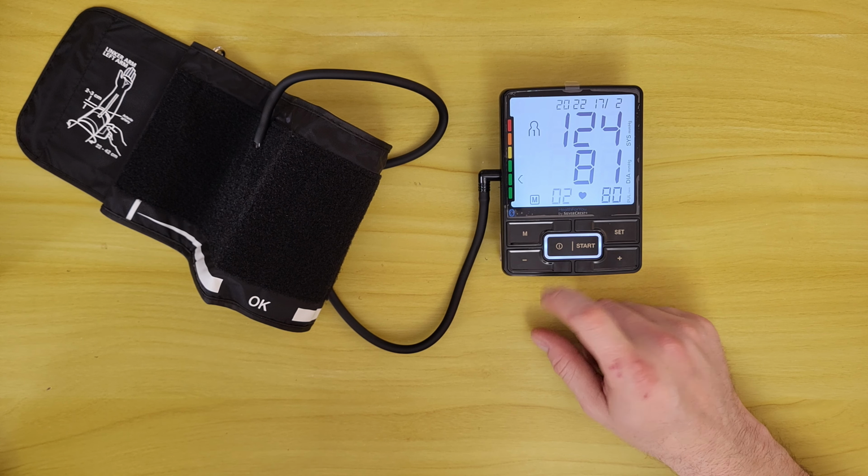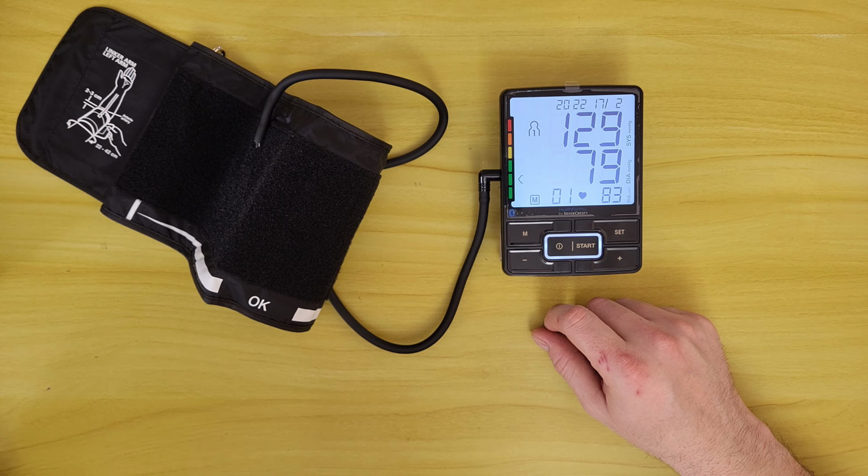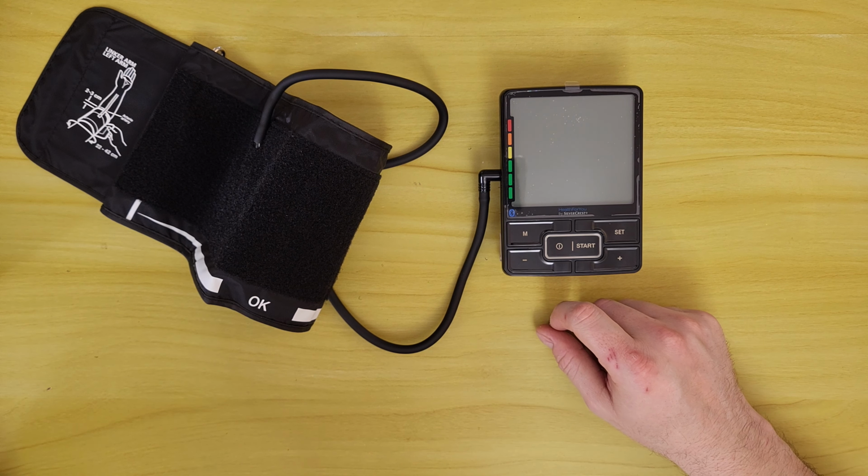Press again, and here we've got the second measurement that I made. And again, press, we've got the first measurement. Press again, it is off.